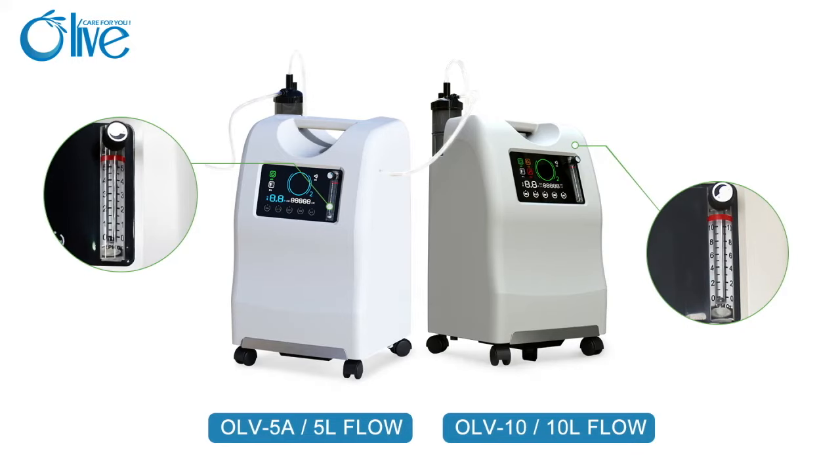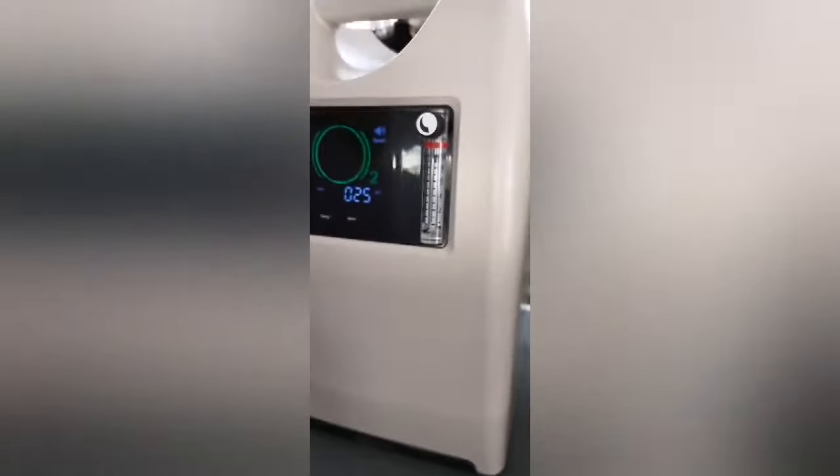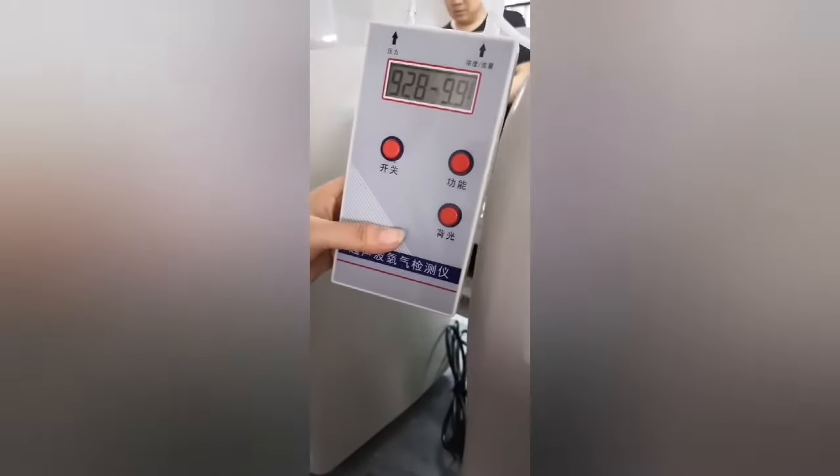This model can provide two different flows: 5 liters and 10 liters. Both flows meet the medical standard, and oxygen purity can reach 93%.